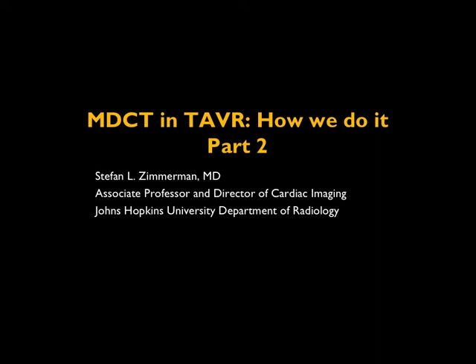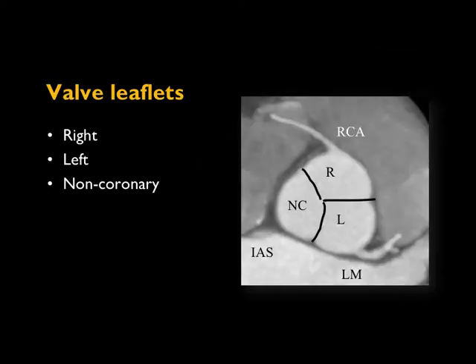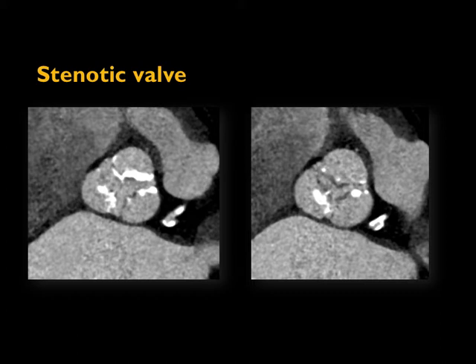This is a picture of the normal aortic valve in systole on the left and diastole on the right, showing the nice tri-leaflet appearance and triangular-shaped opening of the aortic valve orifice. The upper right image is an oblique sagittal three-chamber view showing we're just above the aortic valve leaflets. The valve leaflets and cusps are named based on the coronary arteries that arise from them: the right, left, and non-coronary cusps.